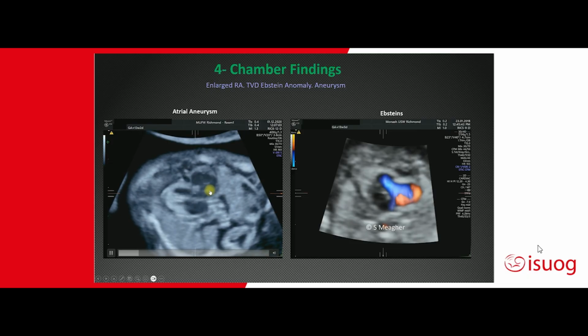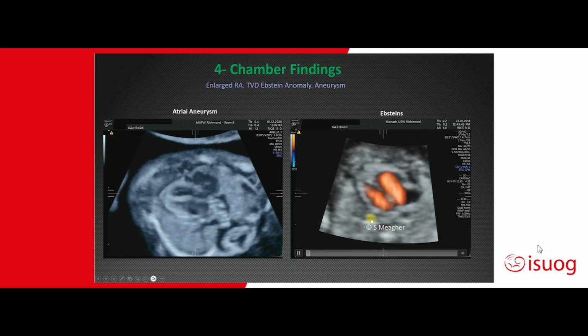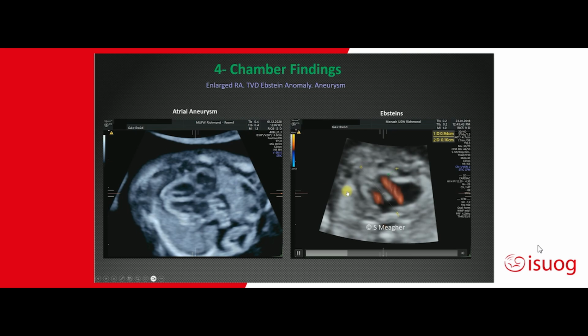rare to see these abnormalities, atrial aneurysms. Descending aorta, left atrium, right atrium with gross dilatation of the right atrium with a regurgitant jet rising deep from it within the right ventricle in a fetus with Ebstein's anomaly.